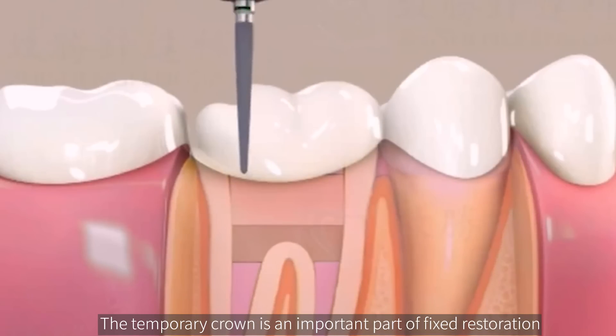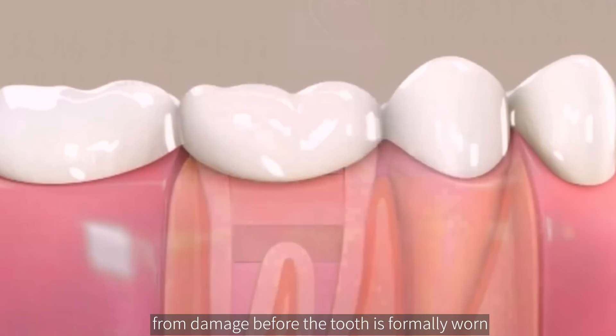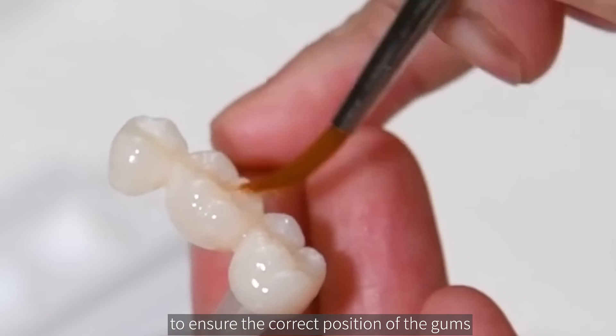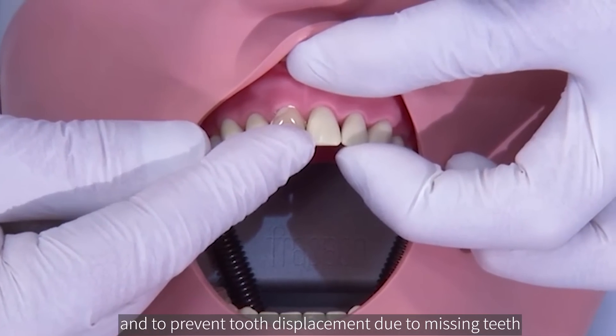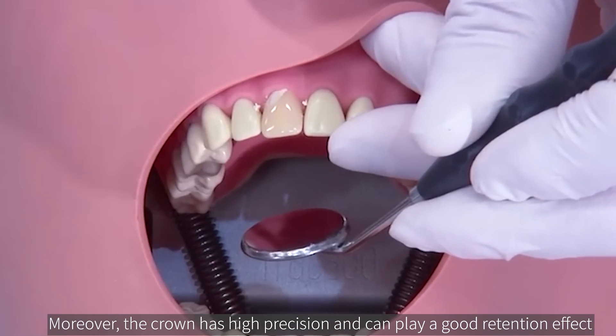The temporary crown is an important part of fixed restoration. Its main function is to protect the pulp from damage before the tooth is formally worn, to ensure the correct position of the gums, and to prevent tooth displacement due to missing teeth. Moreover, the crown has high precision and can play a good retention effect.